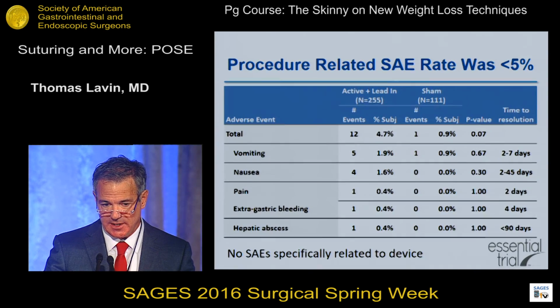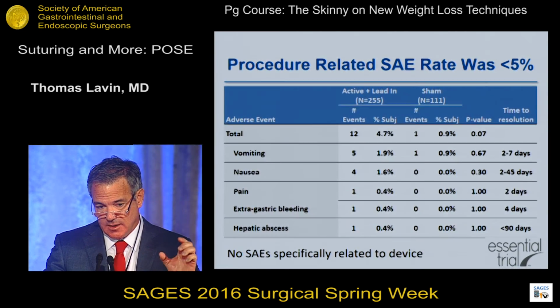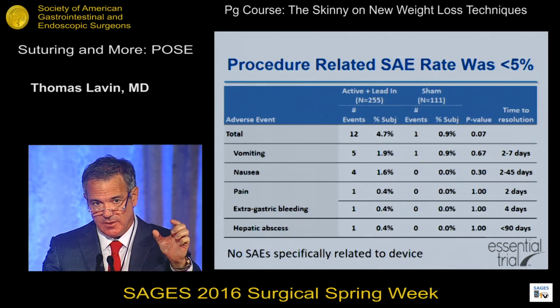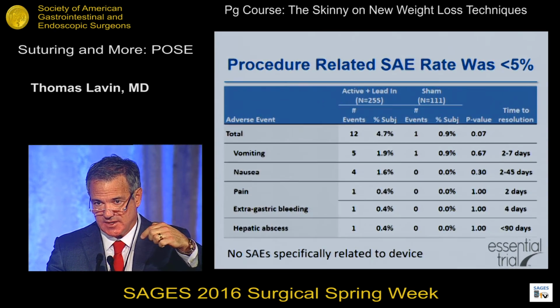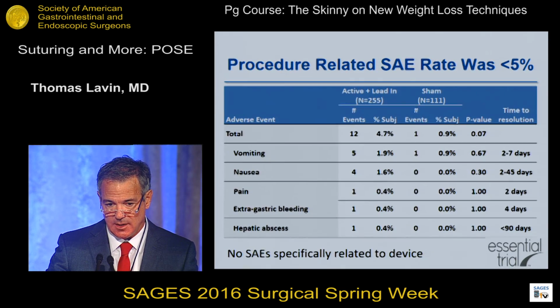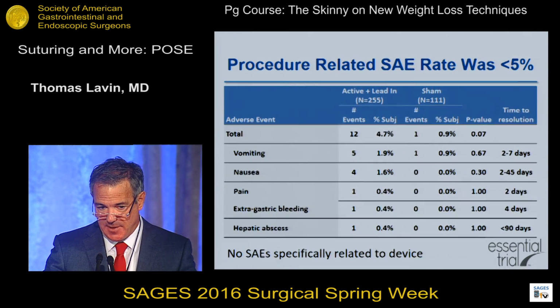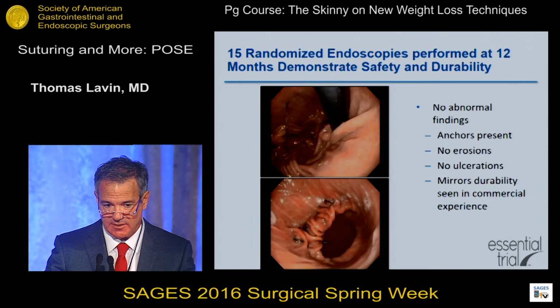The extragastric bleeding and hepatic abscess are the two that were of significance in the active group. The extragastric bleeding went back on the tape, and there was a reason for it. When the investigator placed the device, a needle goes full thickness, and you have to place your basket to tamponade it at that point. And he let go and grasped it again, and that patient required open laparotomy and repair, but she did well. And then the hepatic abscess, there was one case that resolved with percutaneous drainage and IV antibiotics out of the 255 active group.